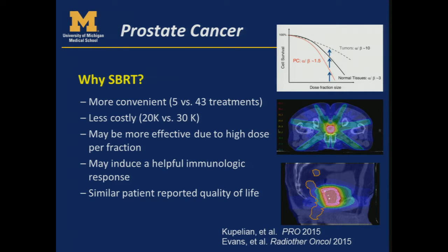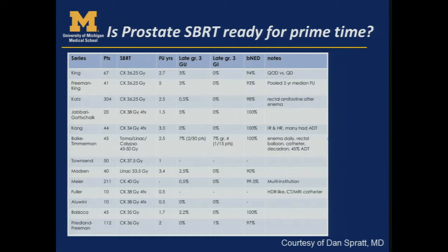It may induce a helpful immunologic response, maybe for prostate cancer, maybe for other cancers as well. And what we found recently is that there's a very similar patient-reported quality of life as well, which has been a concern for some people in employing prostate cancer SBRT. So is prostate SBRT ready for prime time? There are now a couple of thousand patients with a couple of years follow-up. This is a little bit of an old slide, but you can see that the biochemical control is actually quite good, and late grade 3 GI toxicity and GU toxicity are very low as well, so very promising.